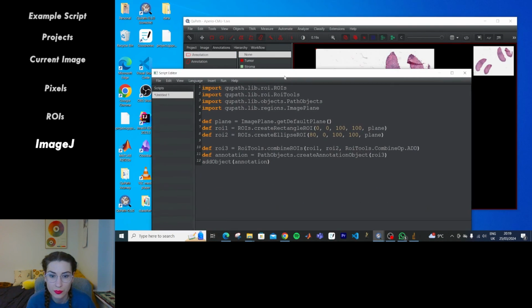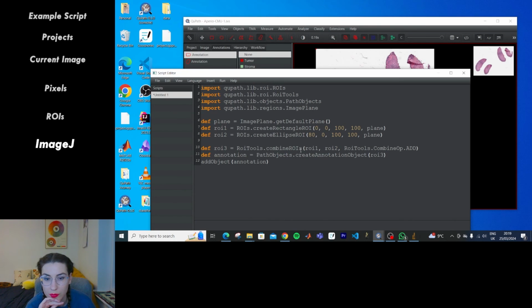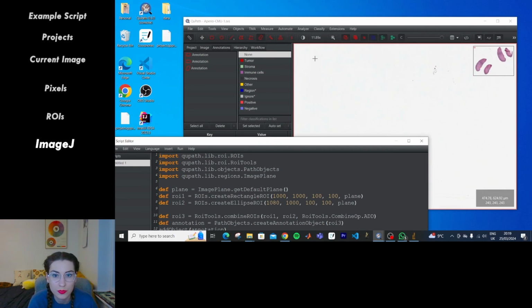So this is all for today's tutorial. This was really about showing you the kind of things that you can do using scripts, but in following videos we'll be looking into more in-depth ways of working with scripts in QuPath.